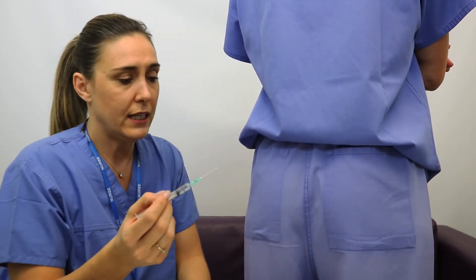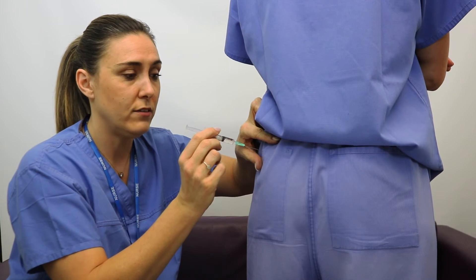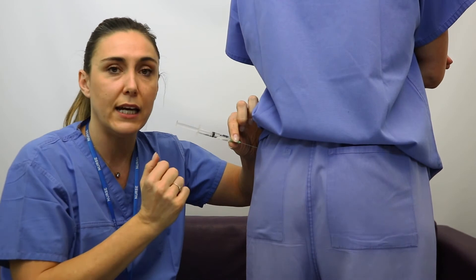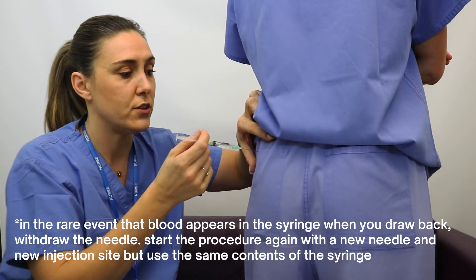The best way of doing it is to hold the skin taut and go straight in like a dart. Once you're in, release and pull back on the plunger and draw back until you see some clear air bubbles. That means you're in the muscle, and then you can hold and push all the way in until all the solution goes in.